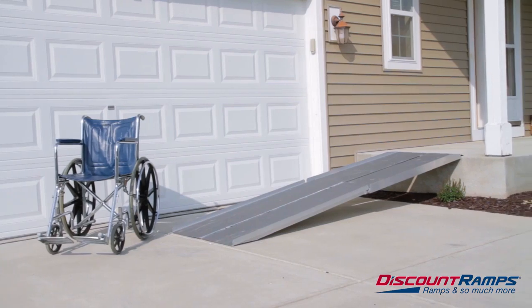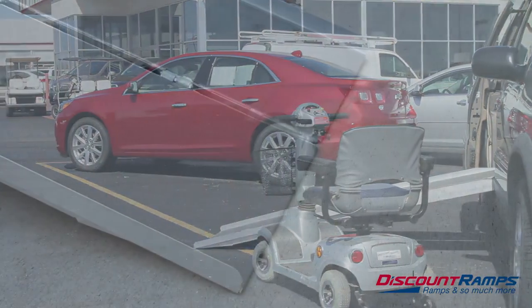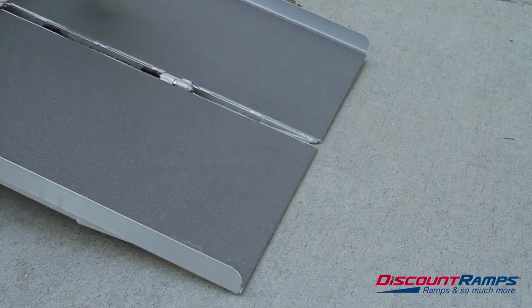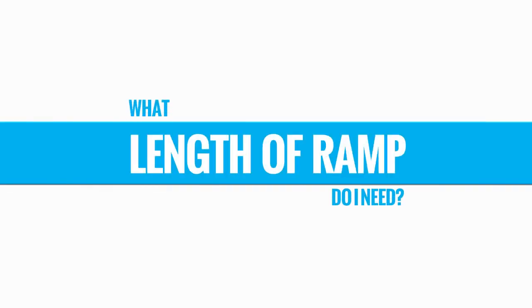If you are shopping for a wheelchair or scooter ramp, you have a vast selection to choose from. In this video, we will go over the different types of ramps that are available for wheelchairs, scooters, and other mobility devices. The first question you should ask yourself is, what length of ramp do I need?